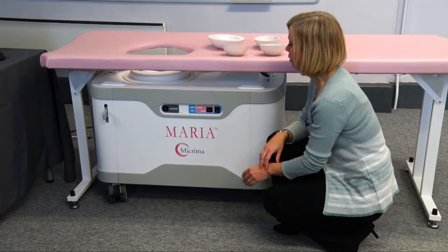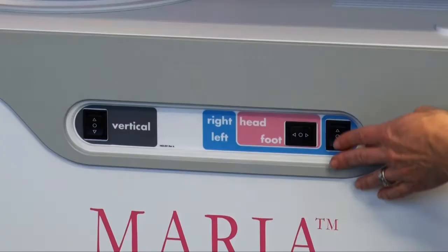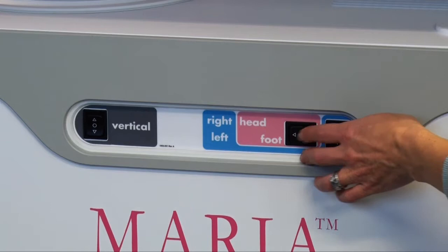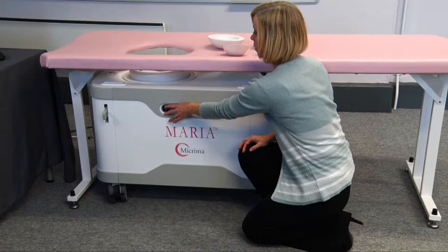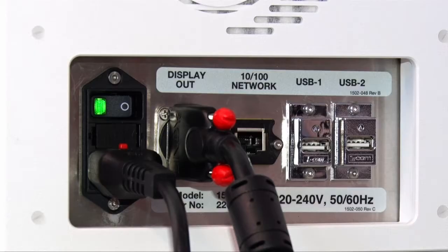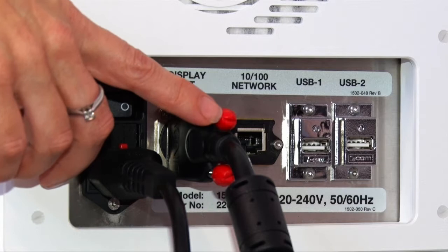The array can be moved for fine adjustment by using these buttons here. This moves the array from right to left and from foot to head. Finally, raise the array to bring the coupling shell into contact with the patient's breast.